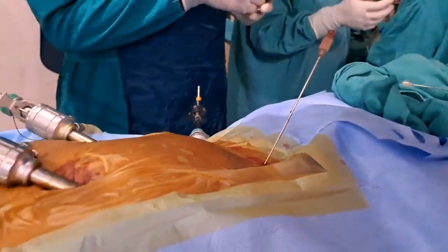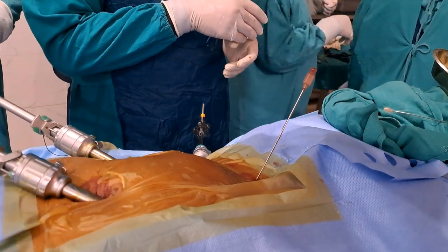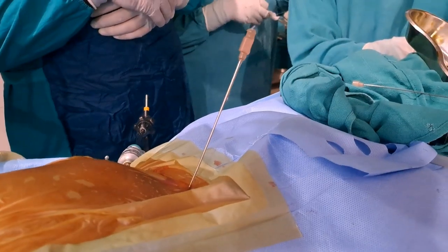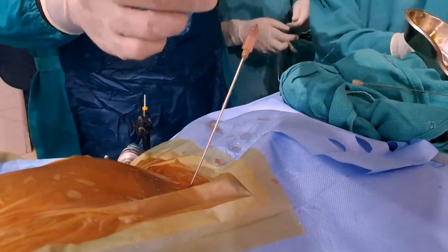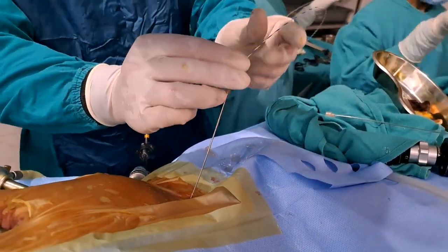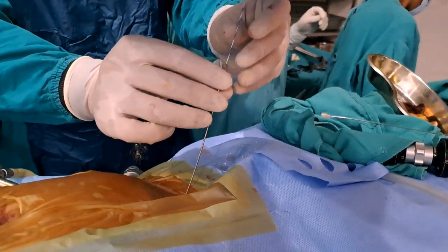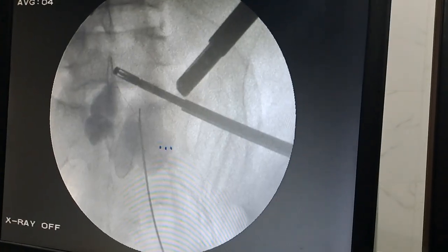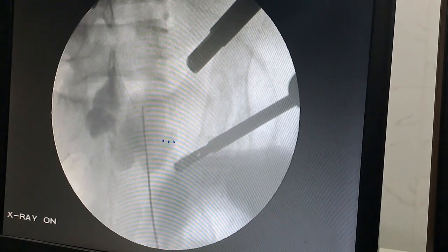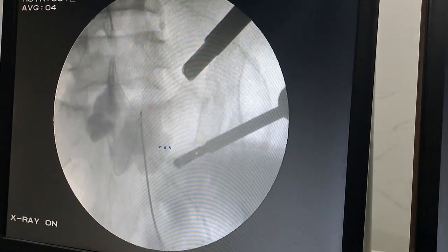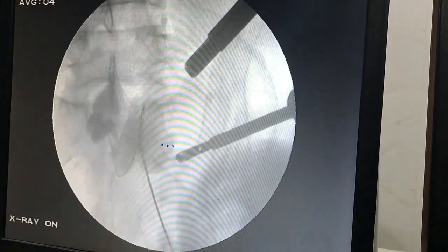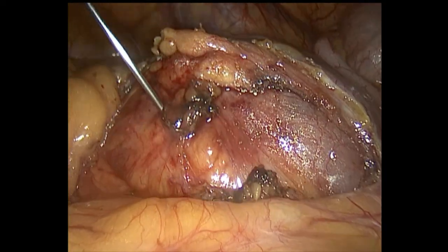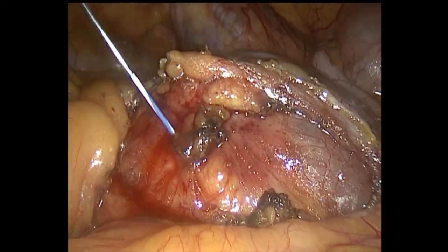Confirmation is done after seeing the free flow of fluid. A zebra guide wire is being used because it is a stiffer guide wire so that it can give stability to the system. Confirm position.